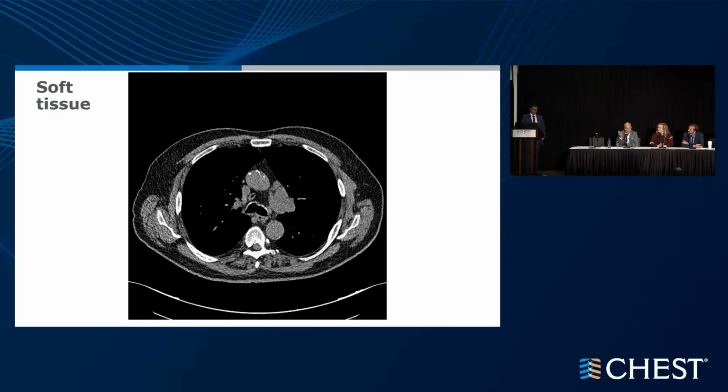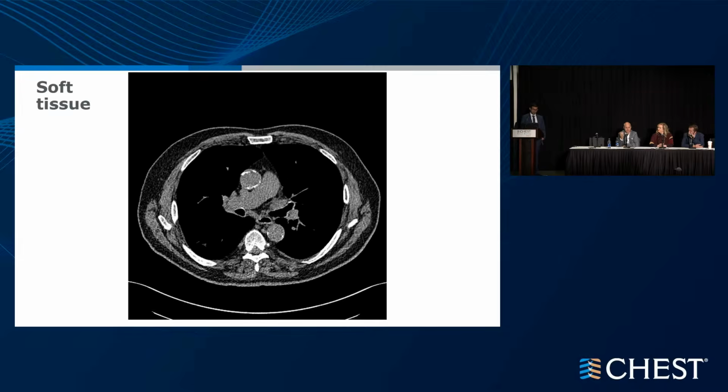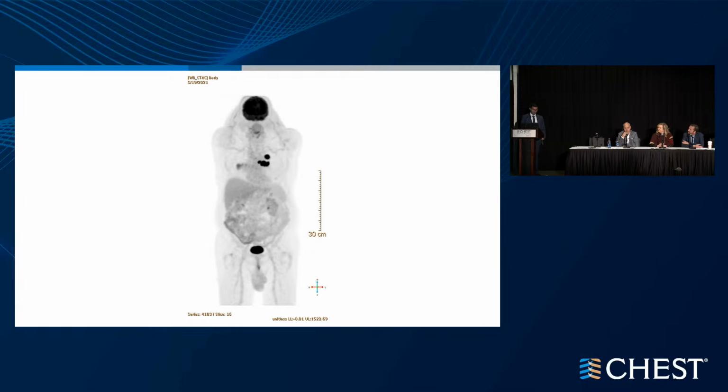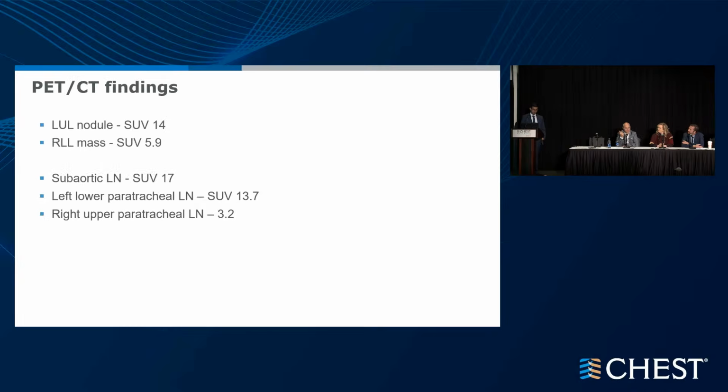I think we all learned that we can keep the lung inflated and navigate really fast, don't suction like a maniac, and add the PEEP, decrease the tidal volume, increase the rate, etc. And with a lesion like that, it's kind of hard to confuse it with atelectasis. When you see atelectasis, it's usually 3-4 centimeters in size, and when you put your radial EBUS in that lesion, you expect a 2 centimeter nodule, not a 4 centimeter mass. So there are ways with the EBUS to actually distinguish between the two.